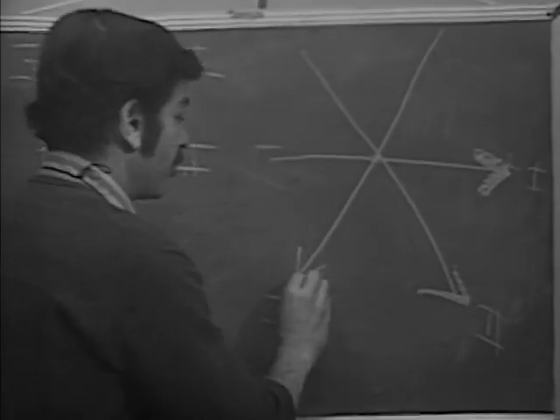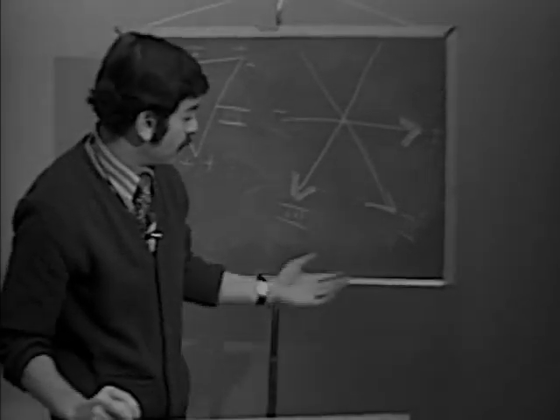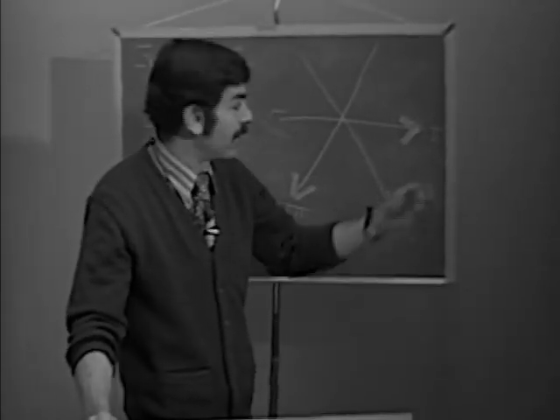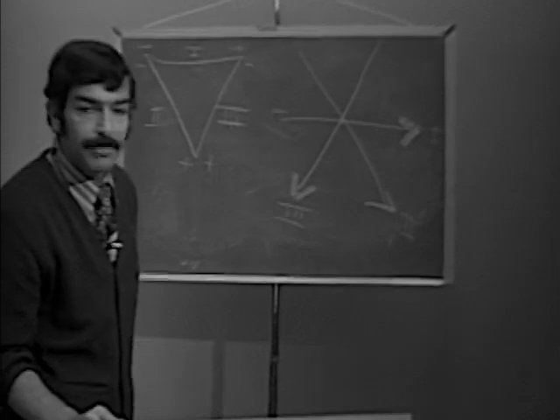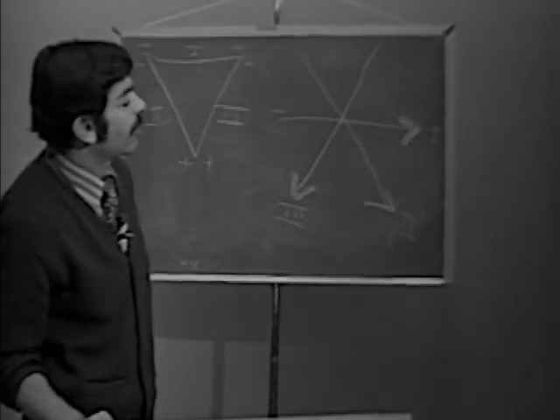Okay, so these are the directions of the 3 bipolar leads then. And this you shouldn't get confused with. Just remember, it always goes around clockwise. 1, 2, 3, right? 1, 2, 3, sweeps around clockwise. You shouldn't have any problem then with mixing up lead 2 and lead 3. Okay, so these are the bipolar leads.